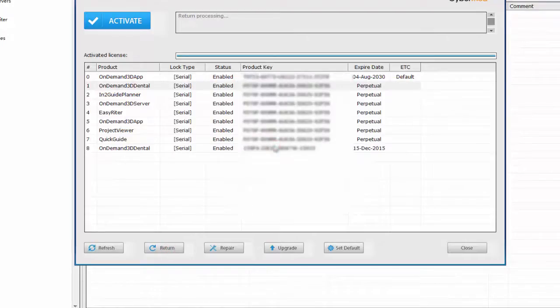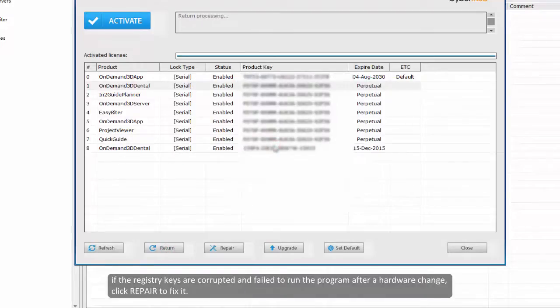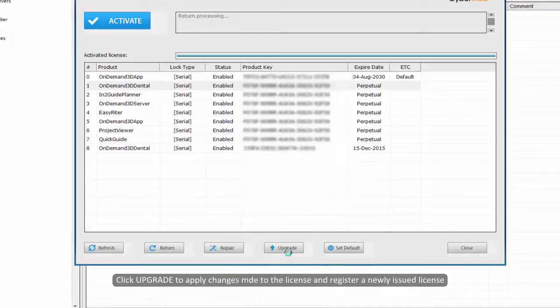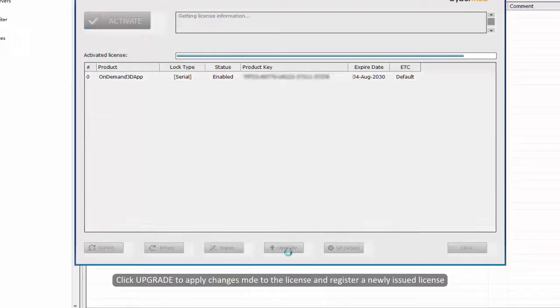However, if the registry keys are corrupt and failed to run the program after a hardware change, you can click repair in order to fix it, or click upgrade to apply changes made to the particular license and register a newly issued license.